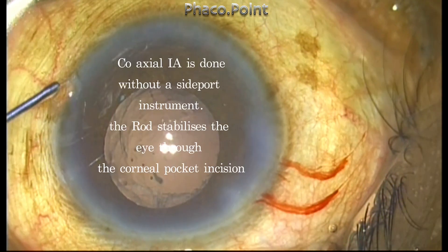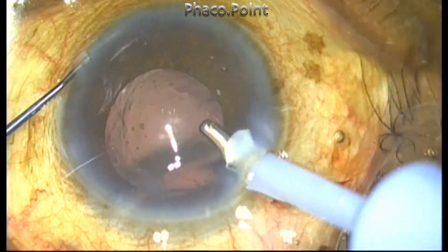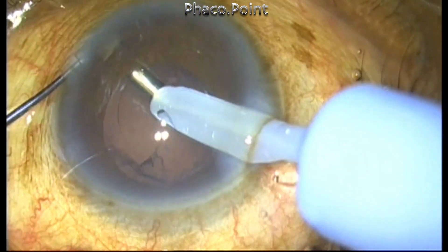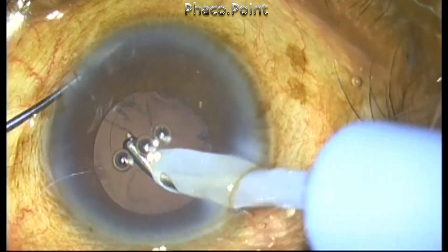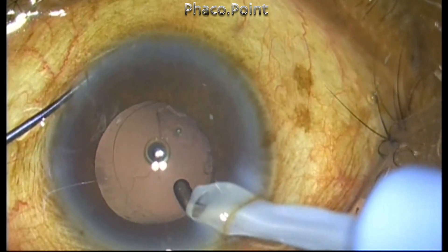The cortical aspiration is also done just by stabilizing the eye through the corneal pocket incision — there's no sideport use. This is possible only if you have a coaxial IA system; if you have a bimanual system you have to do it with both hands.